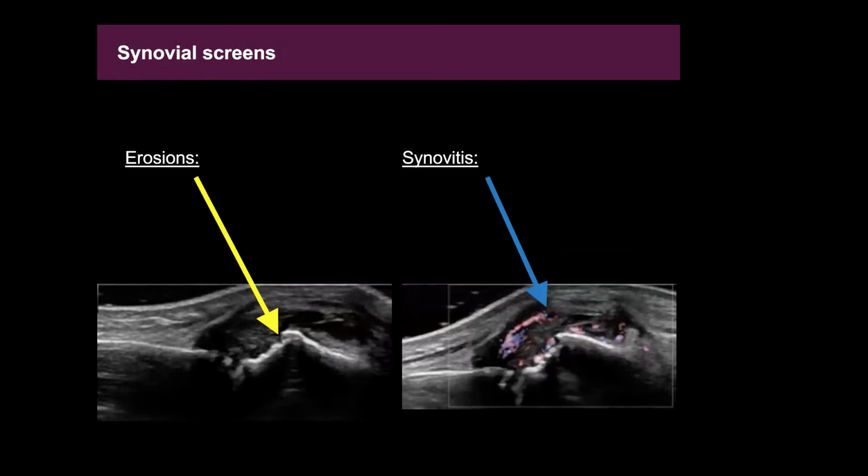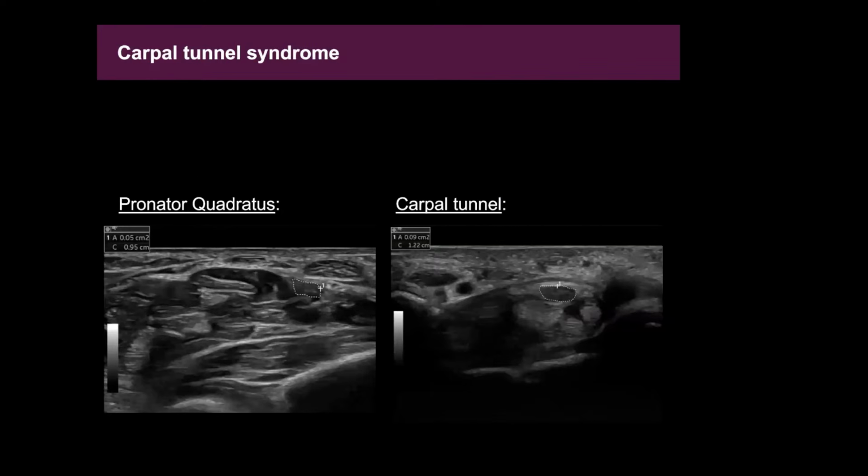And you could certainly put on your color Doppler or your power Doppler and see if there's any significant amount of synovitis. When you're doing these examinations, you want to put a little bit of pressure on your probe to displace any fluid so that you could get a good idea of how much synovitis there is rather than how much joint effusion there is in these patients. And the thickness of the synovitis is something that you could follow over the course of time with treatment to see if that synovial thickening decreases over the course of treatment time. We don't do this frequently, but we can.